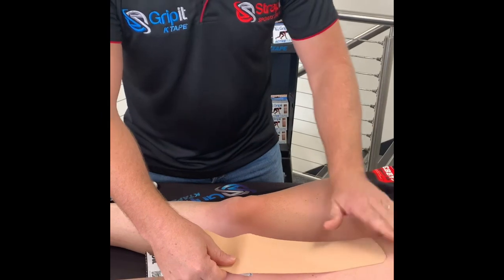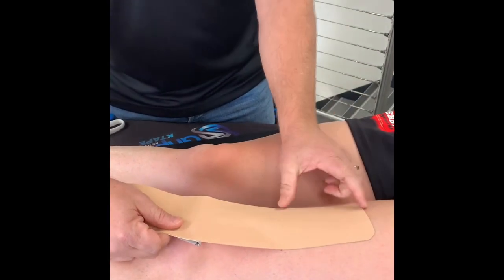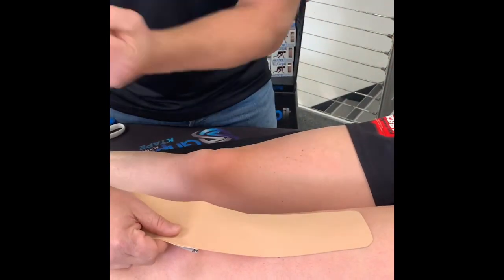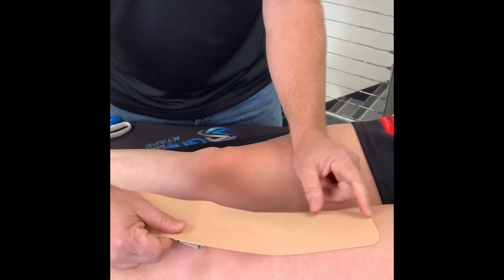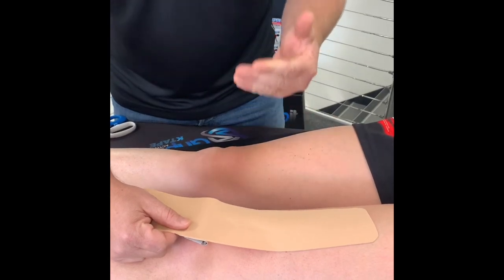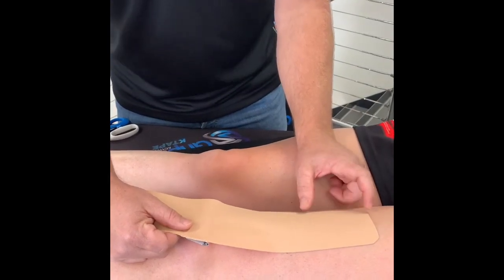So you can see here, I have around about a 3-inch, 4-inch anchor, okay? And I need to make sure that that is without stretch and it's very long, okay? So see, as long as my finger's there, okay? The reason we do that is as the body starts to pull on the tape as we move, the tension will go into this anchor. If we've got a very small anchor, that means we only have a small surface area where the tape's pulling on the skin, which means that there's a higher risk of that small area bleeding and getting some blistering. If we have a large anchor, we stop that from happening.